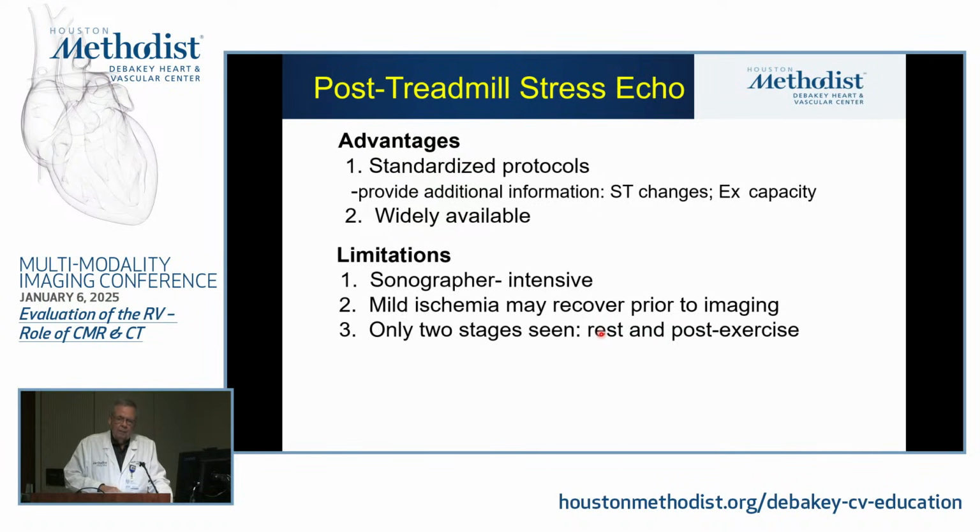You get your resting images. When the patient jumps off the treadmill, you know you have 90 seconds to get it done well. And therefore, you have to not only get images, but you're trying to reproduce the same tomographic planes that you had at rest. And that is not always obtained. Sometimes when you put them side by side, you notice that they're not exactly the same. So it's a very challenging technique. And if you want to talk about the number one Achilles heel of stress echo, particularly with the treadmill, it is the importance of expertise on the sonographer's part to be able to do this.